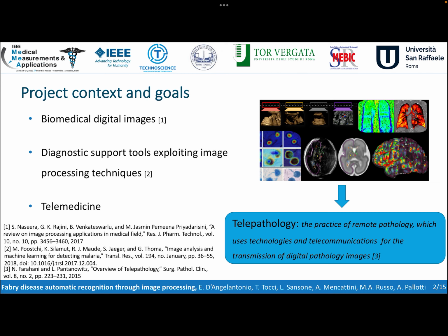So biomedical digital images are at the heart of medical science, fundamental in diagnostic processes and in understanding the anatomy and the physiology of the human body. Biomedical pictures can photograph entire body regions, entire organs, or only a tissue or few cells, as in the case of histological examinations. Working on digital biomedical images allows to develop and apply image processing techniques in order to develop some diagnostic support tools for the physicians.